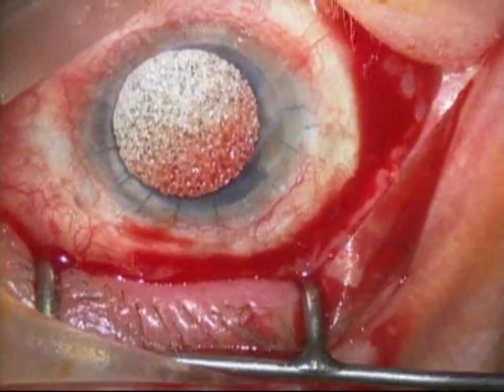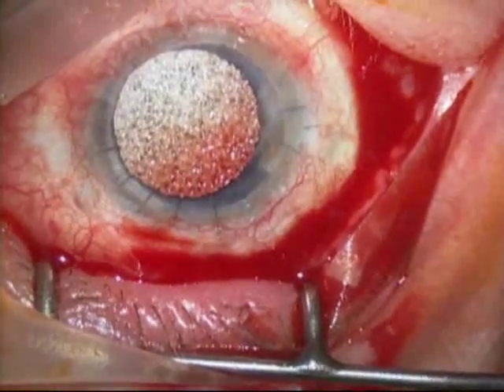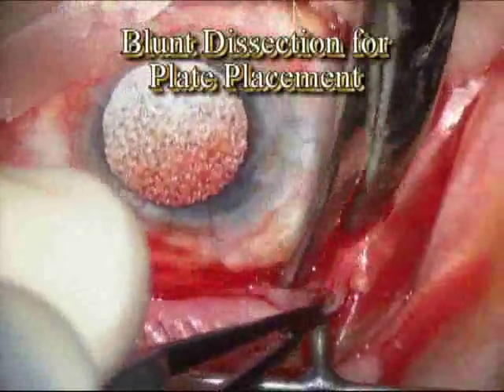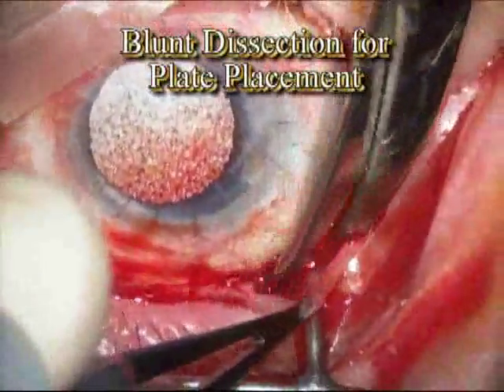This patient has previously had a corneal transplant and that's why you see the stitches in the cornea, which are the little black lines at the top of the picture.